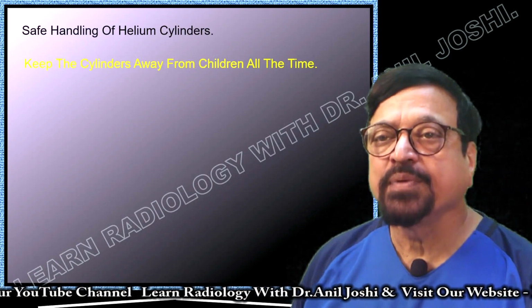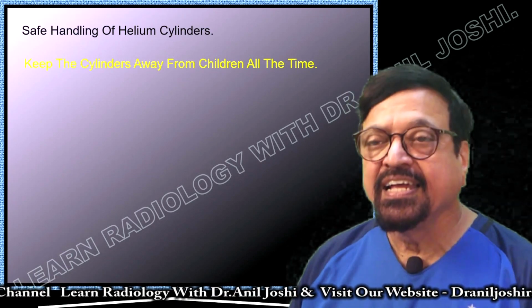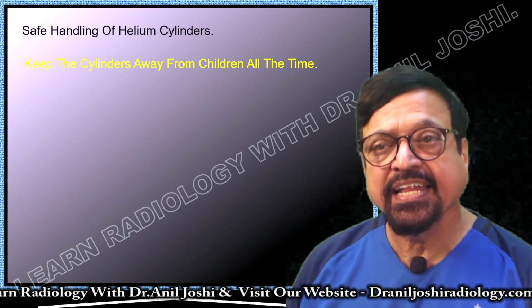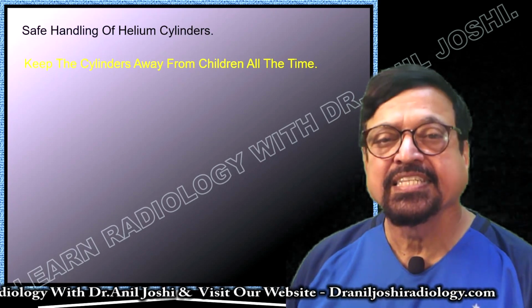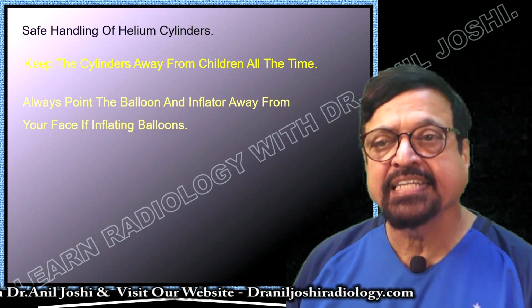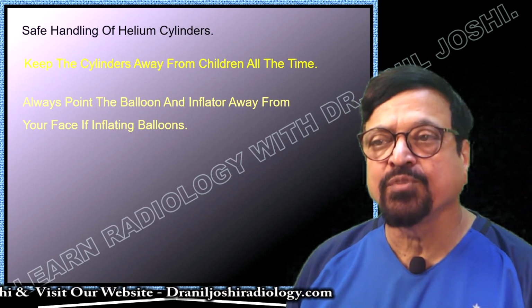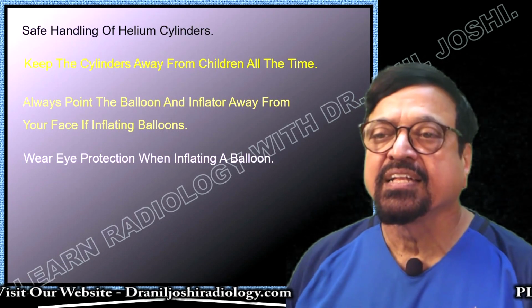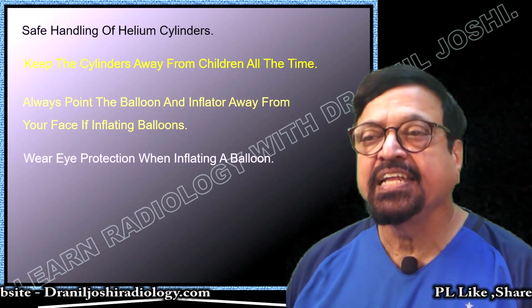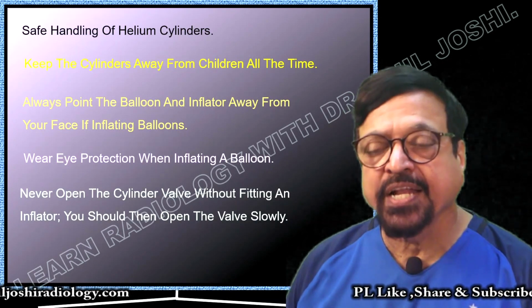Now helium has to be handled safely. As I told you, it is safe, it is inert, it doesn't cause any side effects. However, safety precautions have to be taken. Of course, the cylinders in the MRI machine are designed such that nobody can go there except the service engineer. So it is always away from the patients as well as from playing children. There is always a necessity to wear eye protection when inflating a balloon, but that we are not going to see because that is not a topic of our lecture.